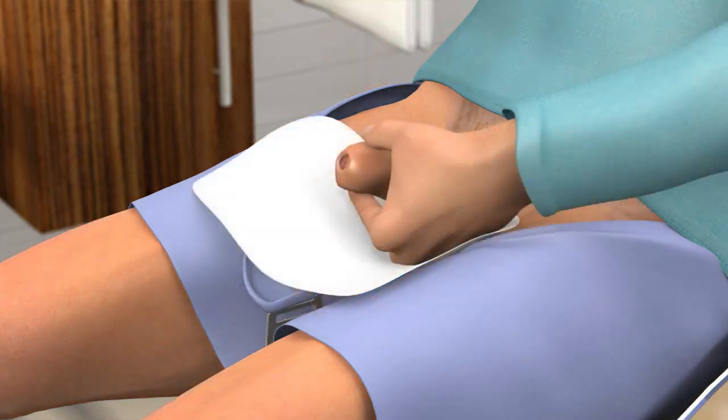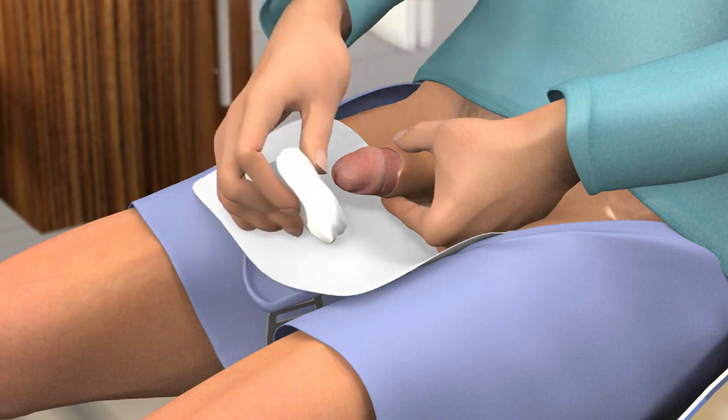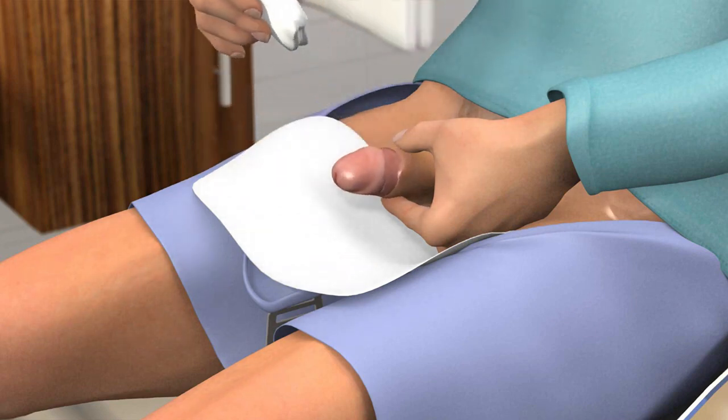To prevent pushing bacteria into the urethra and bladder when you use the catheter, you must first clean the head of your penis properly. Gently pull the foreskin back and wash the head of the penis. To remove any bacteria that might be present at the opening of the urethra, wash in a circular motion starting at the urethra and working outward. Use each wipe only once.